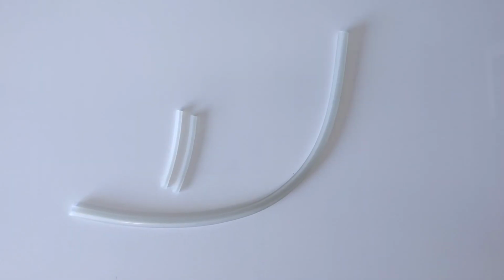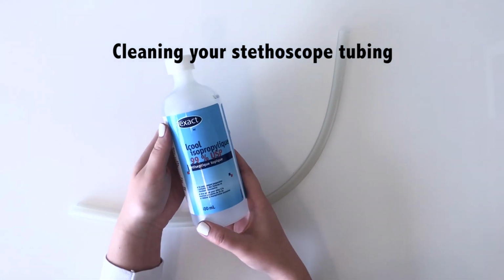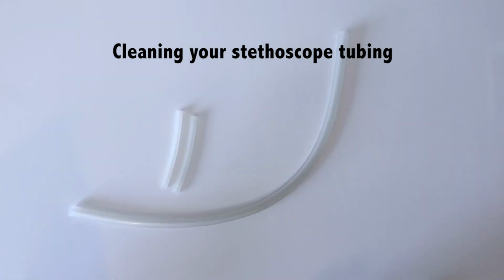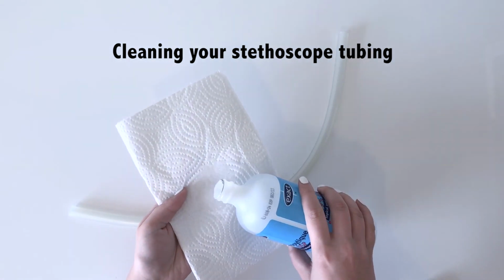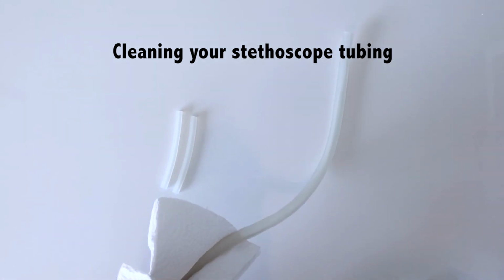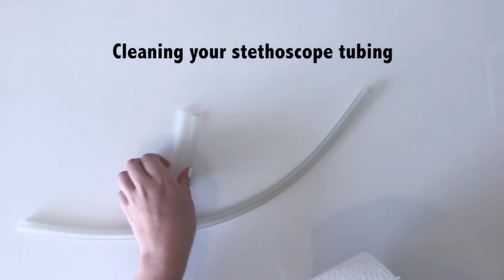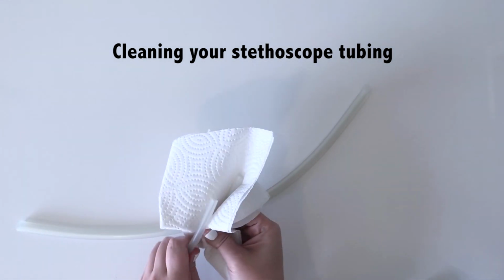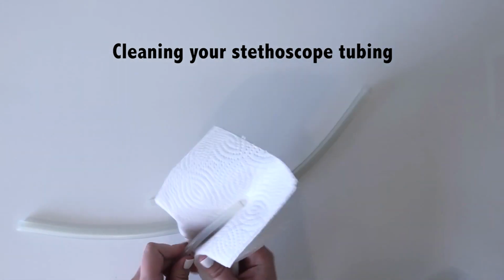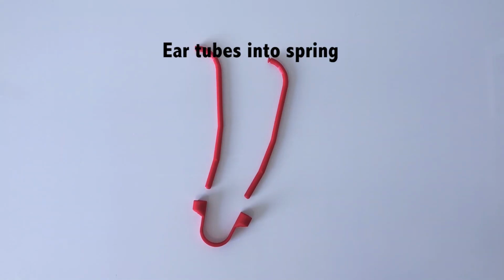Sometimes, during packaging or transport, dust can collect on your tubing. We will begin by cleaning the tubing with isopropyl alcohol, also known as rubbing alcohol. This can be used at any time to clean your stethoscope. The tubing is one of the only parts of the stethoscope that is not 3D printed. However, it is the same tubing used in Coca-Cola beverage machines, and therefore is found almost everywhere in the world. Now we will start with assembly.